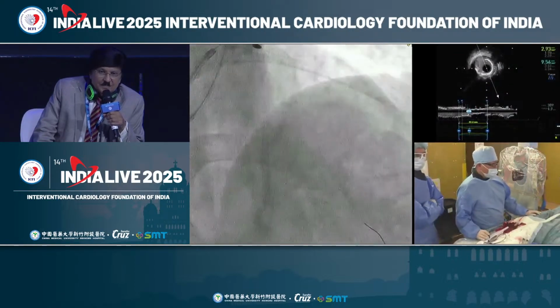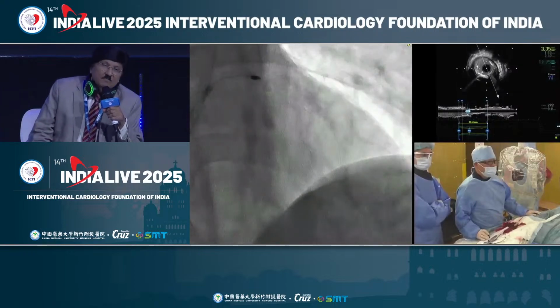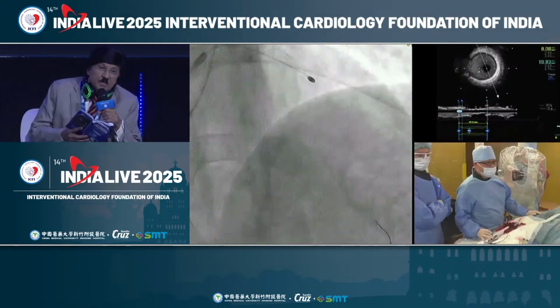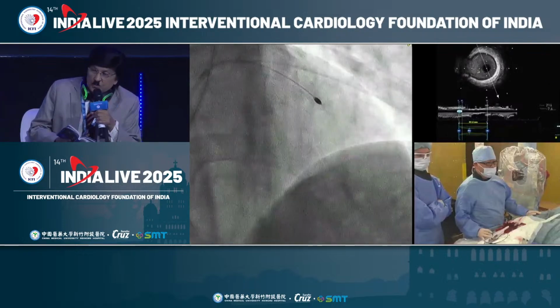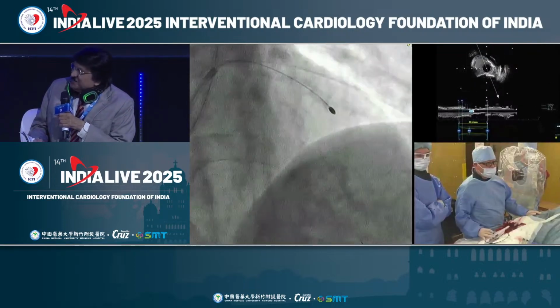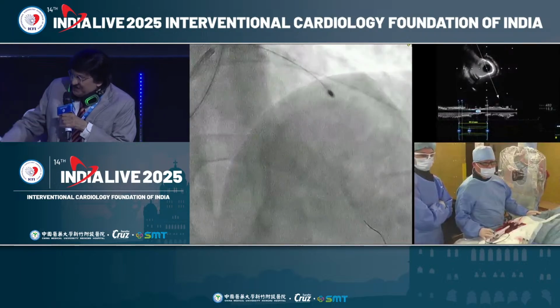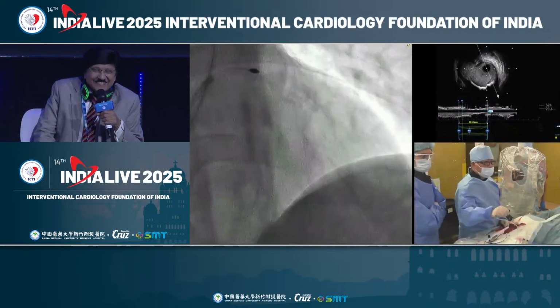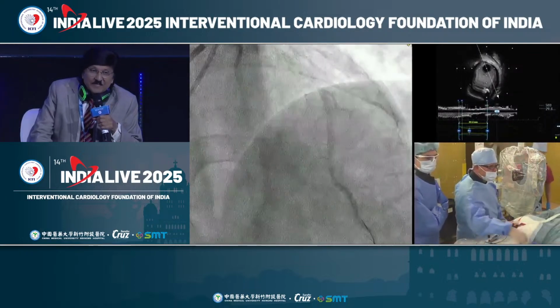Yeah, this might show. Right. So now, I think for the audience, you should remember Professor Kashima's name, in case you are not a proponent of IVL and more a proponent of rotablation. So you always have one argument with you. Yeah, quite large. So let's see with your 2 millimeter rotablation.